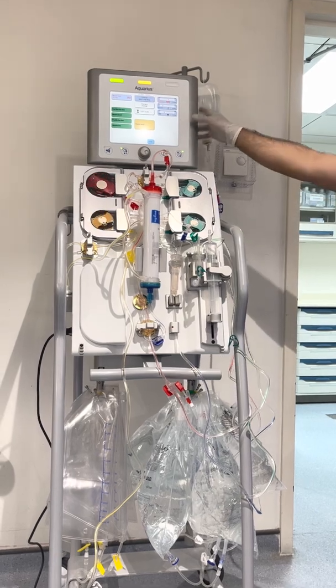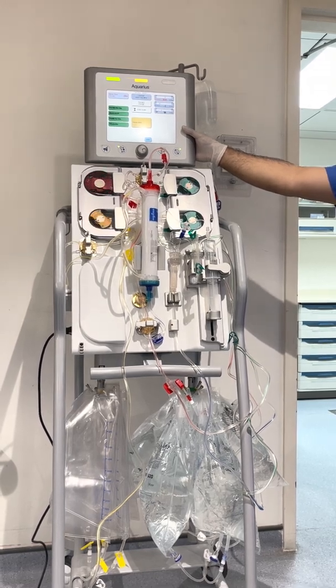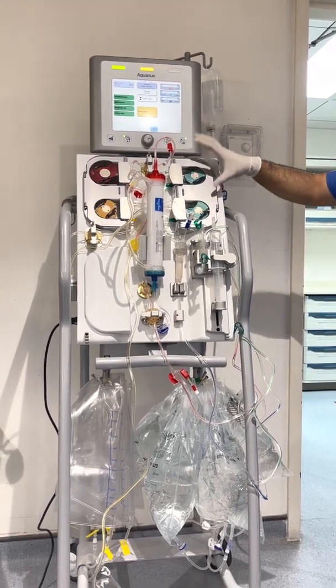So the first one is I think 8 minutes. And the clamp test will take maybe less than 1 minute. So that it's already zero. It will automatically stop.